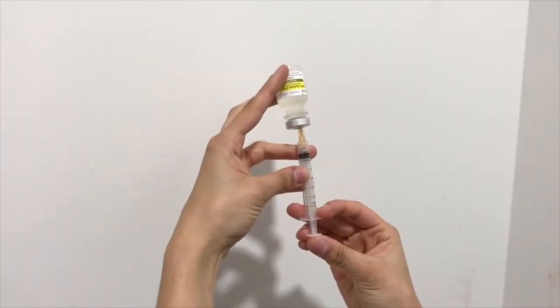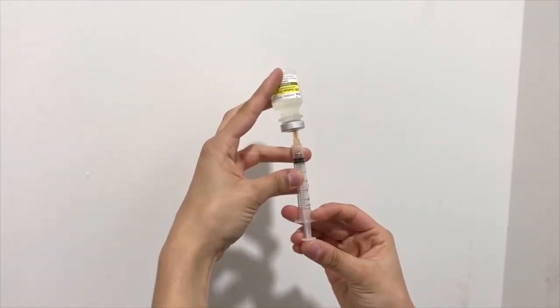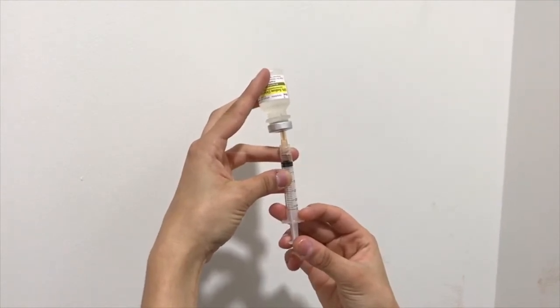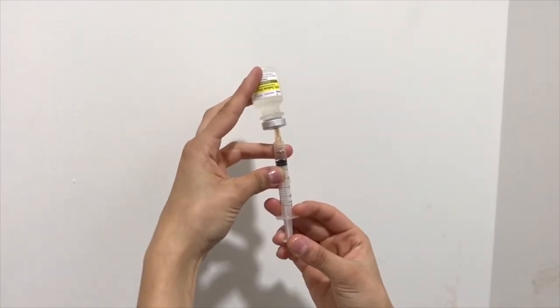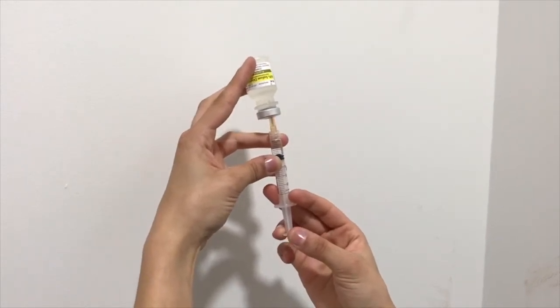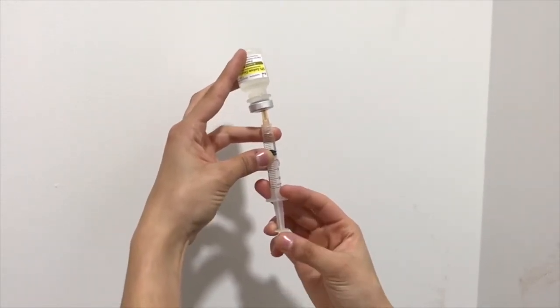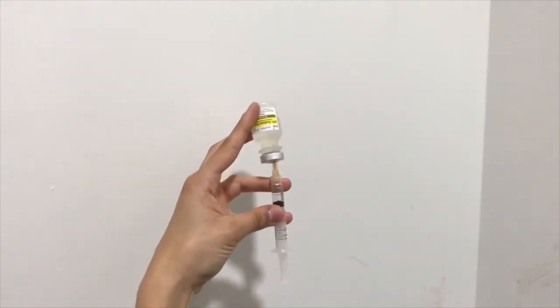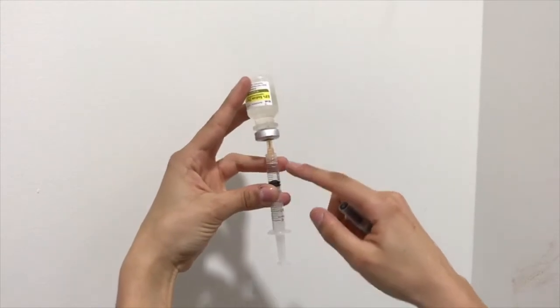So it's important that you are taking the medication up slowly to try and ensure that you don't get air bubbles, but eventually it is inevitable that you do get some type of air bubbles. As you can see, it's forming at the top right there. You want to make sure that the top part of the plunger is at the 1 milliliter line in this case. So there are some air bubbles, as you can see, right at the bottom and at the top.